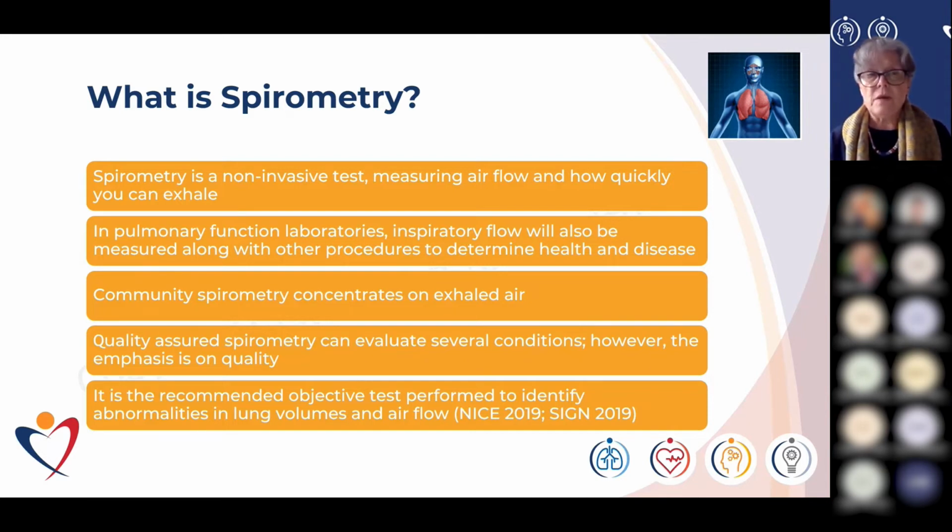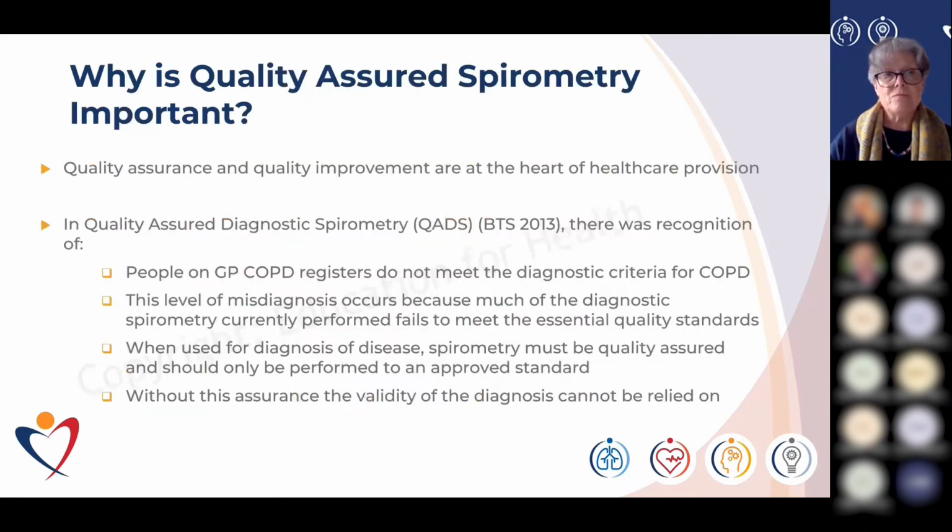But quality assured spirometry can evaluate several conditions. However, the emphasis really is on quality. And it is a recommended objective test to perform and identify any abnormalities in lung volumes and airflow. And that's put forward by NICE and SIGN.